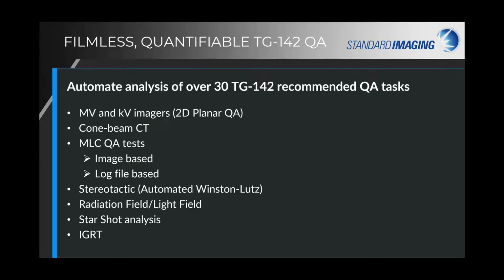So all these are part of the PIPSpro standard package, and it does, like I said, over 30 different TG-142 recommended QA tests. And if you get in touch with us afterwards, we can get you a listing of those tests that are performed and recommended by TG-142.